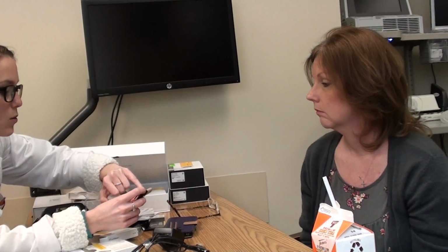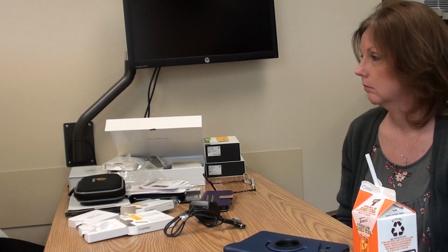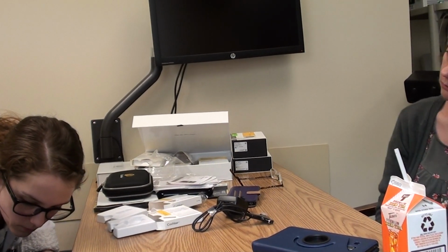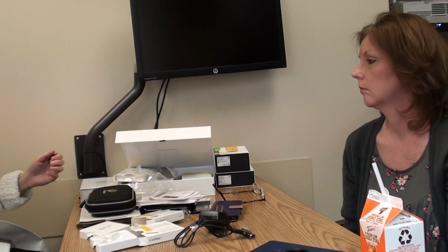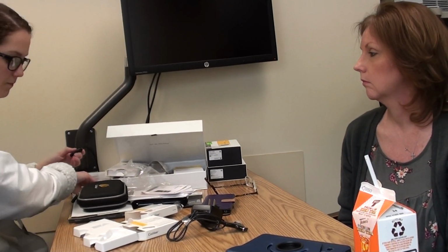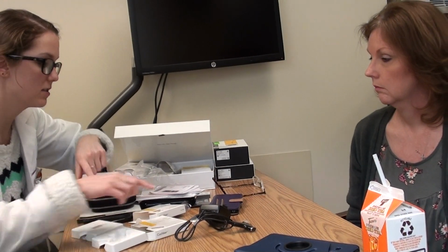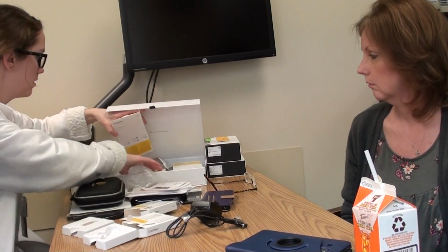So same thing with this one. Line up the green light with the hole. Yep, and then that green light will blink. Okay. So I only had to put on the charger for a second, right? Mm-hmm. All right, so you have a couple extra batteries, so you'll rotate through those.